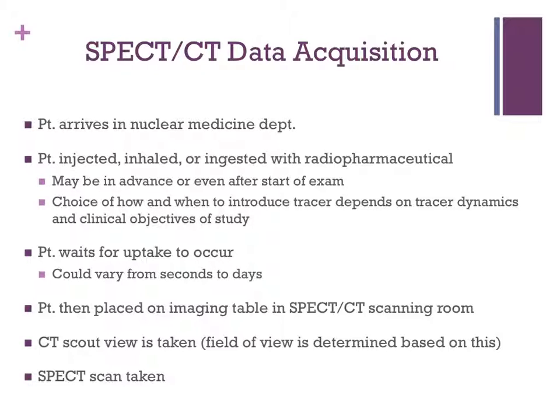The patient is then placed on the imaging table after waiting the appropriate amount of time for the uptake of the radiopharmaceutical. A scout CT image is taken, and based on this, the field of view is determined for the study. The CT study is acquired, followed by the SPECT study, and the CT and SPECT studies are reconstructed and registered to provide the fused image set for review by the nuke med physician or radiologist.